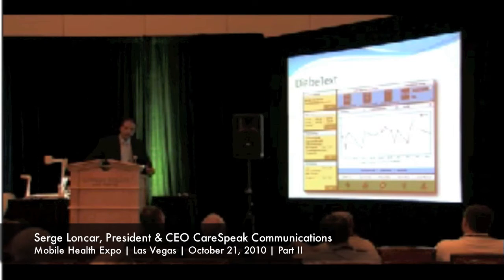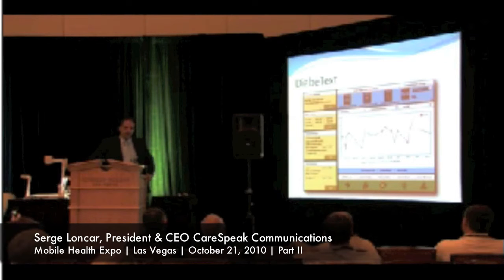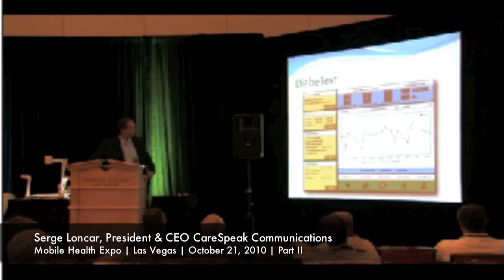I remember, when Dell launched the personal computer, they learned people didn't know how to plug in their cables, so they color-coded them. So we kind of followed that logic and said, the left yellow will be basically the account settings summaries. The blue area will be the patient data view, and the green is kind of the communications tools.